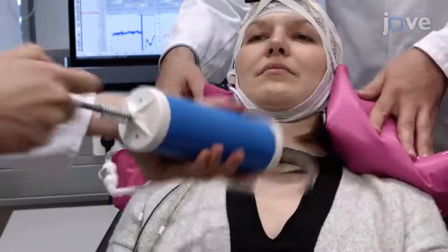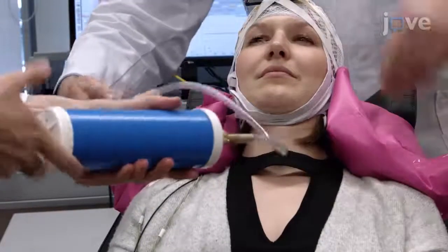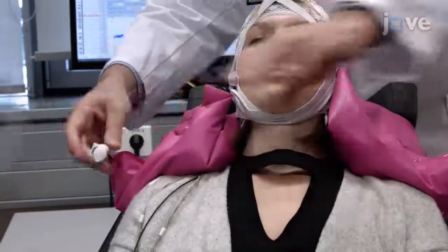We need a stable and clean EEG signal. The key is a well-prepared study participant who is relaxed, comfortable, and able to sit still. This is an easy-to-use plug-and-play method to investigate whether large-scale cortical connectivity states have causal effects in perturbation-based experiments. Looking at one localized oscillation, that's just the first step.